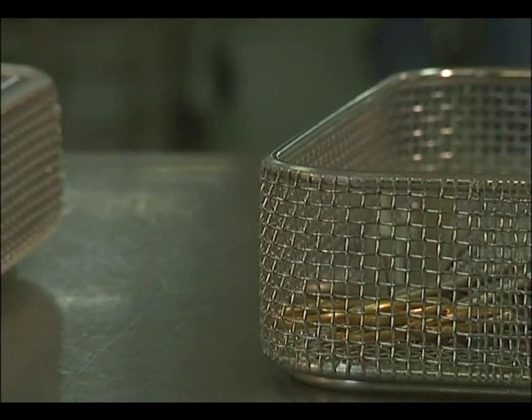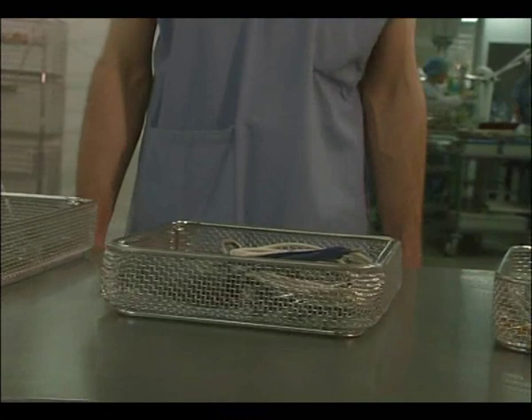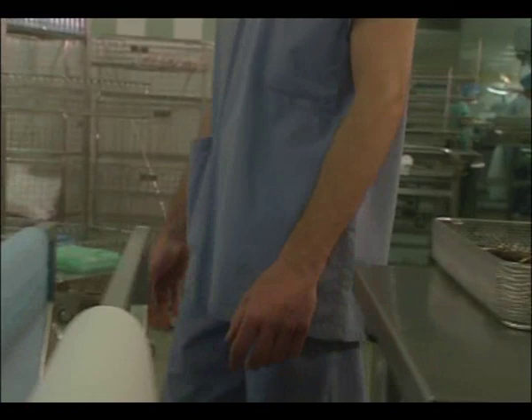Here we are in the hospital sterilization center. Surgical trays containing instruments previously cleaned, disinfected, and checked must now be sterilized. Because trays vary in size and weight, the first step is to select the sterilization wrap best suited to guarantee the strength of the packaging.